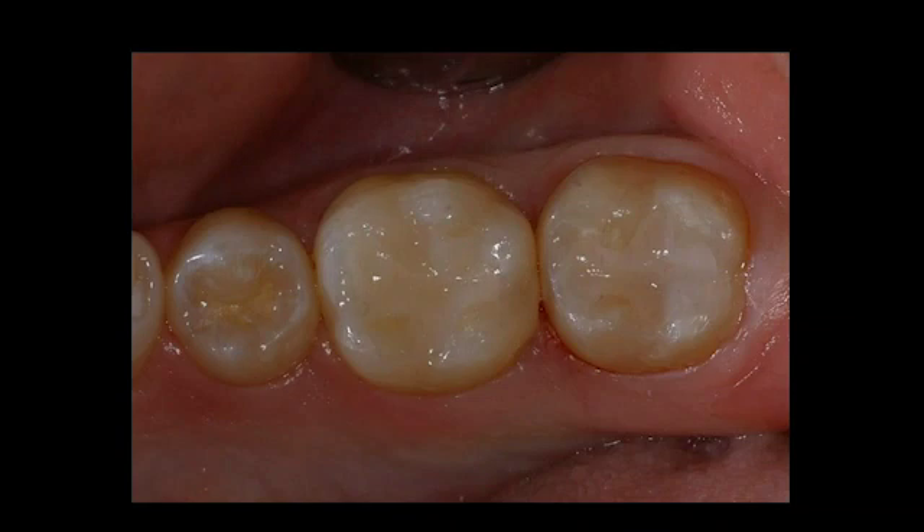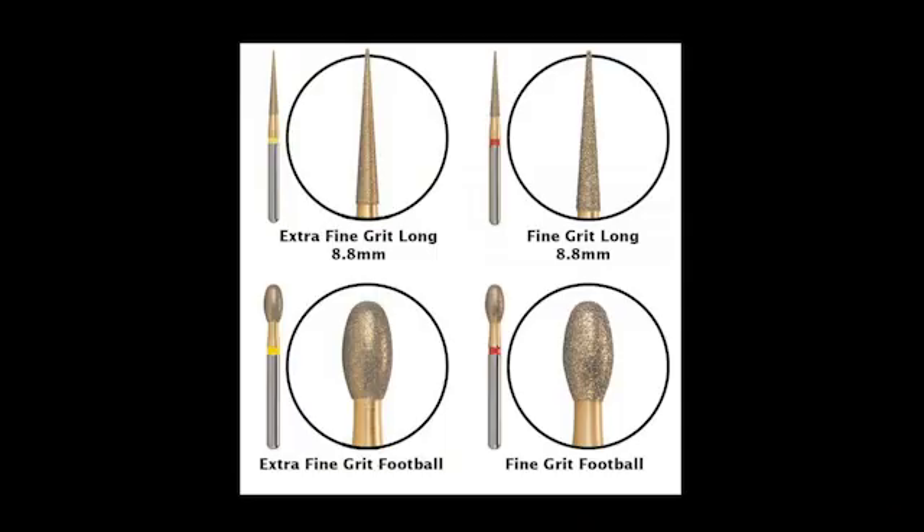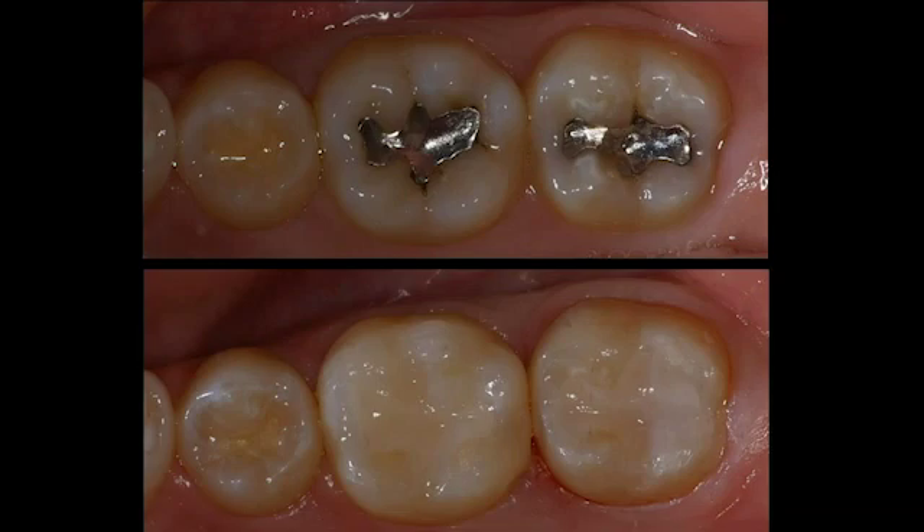Here you can see very quickly, using this method, we're able to place the Wago Fill composites. Wago Fill comes in three shades: A1, A2, and B1. Again, this is a posterior composite; because of the zirconia particles it will look slightly opaque, but in the posterior portion of the mouth that doesn't really matter. Once we've shaped it, I'll go ahead and adjust the occlusion starting with a fine red diamond and finishing with a yellow. Here we can see the before and after — once the patient was anesthetized, these restorations were completed in about five to seven minutes.